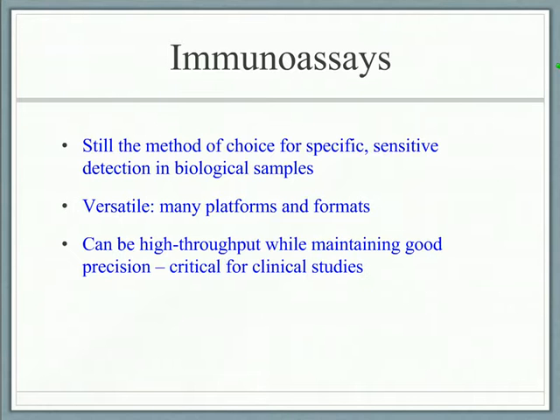Also, the value of antibody-based assays is that they are particularly well suited for clinical studies where there's a requirement for being able to run many samples while maintaining good precision so that we can build up statistics over large patient cohorts while getting good measurements on each patient. Some high throughput assays are not very precise, and other assays can give good multiplexing but not good precision or can't give good throughput. So antibody-based platforms have those combined capabilities.